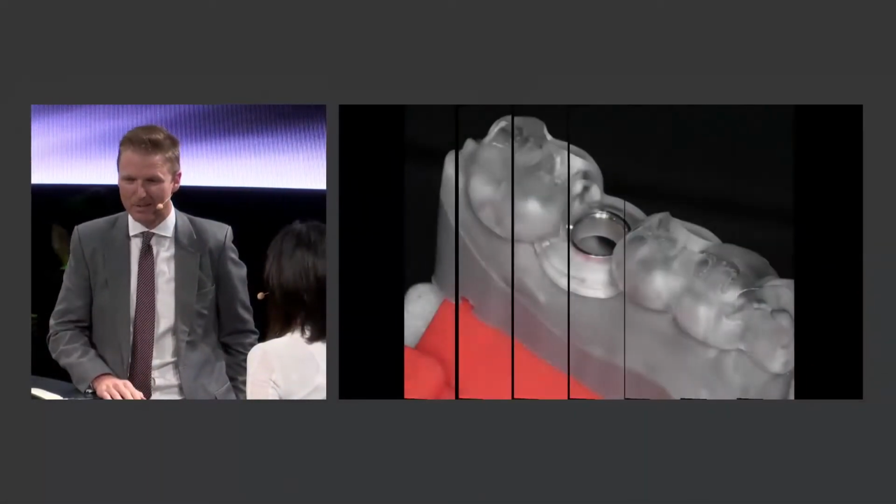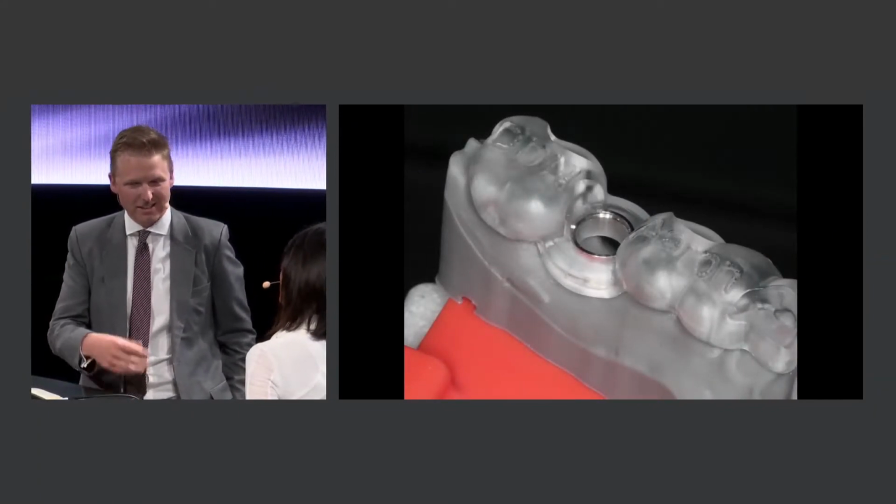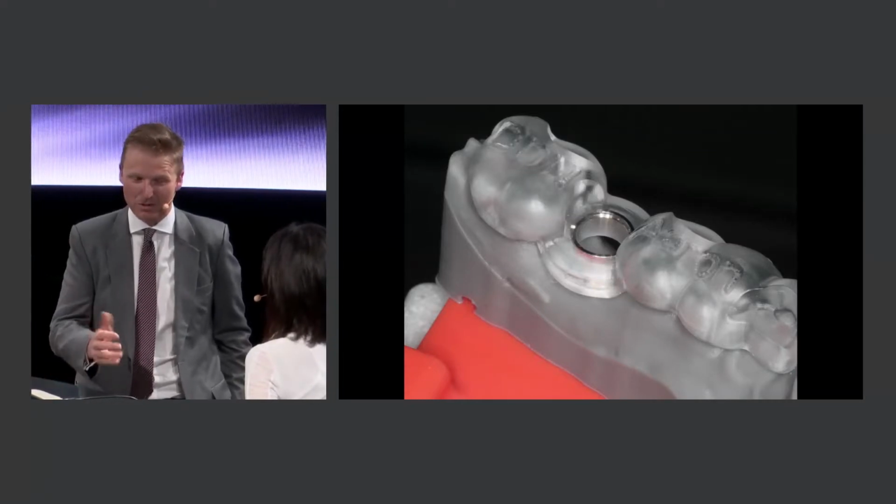Talk to me about that. How do you feel about it? Does that resonate with you? Is that accurate for you? No, that's a huge part of that decision process. And I think, mentioning before about seeing a wide variety of implants, we also see a wide variety of implants over time. In Australia, particularly in the 70s and 80s, there were a lot of brands that were placed that now no longer exist. And as a prosthodontist, we often get those cases and you have to restore them.